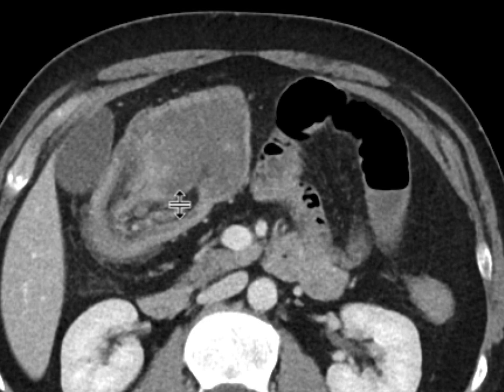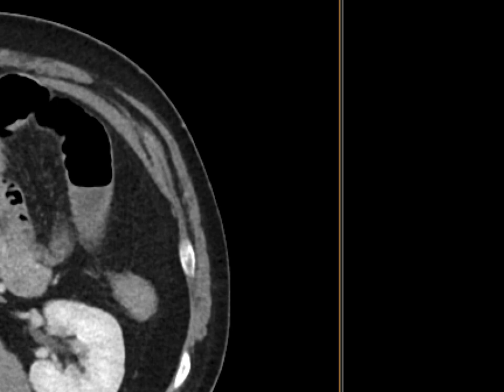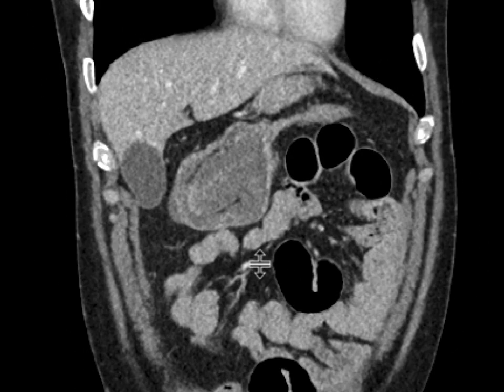In this instance, you can see there is a mass really at the tip of this intussusception serving as a lead point. It's hypodense in its attenuation. This was resected, and it turned out to be a mucinous adenocarcinoma.